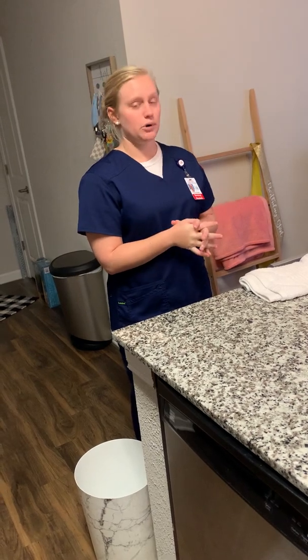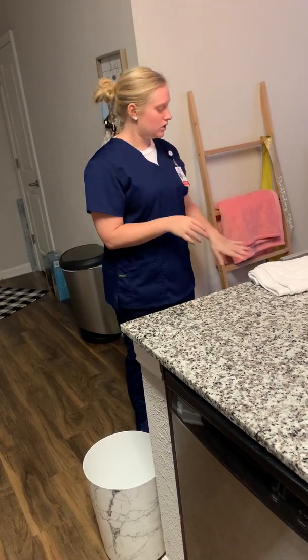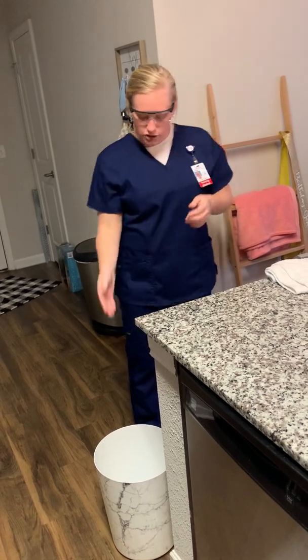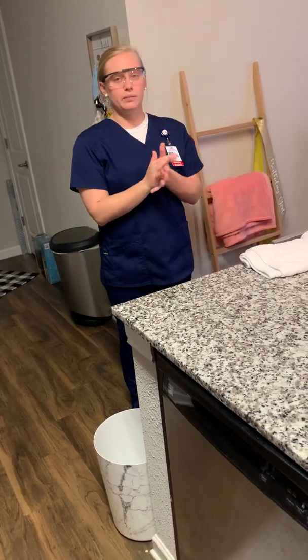I'm going to provide privacy for my patient, so I close the curtains, and then I want to gather all my equipment, which I have here. I'm going to don my goggles, move my trash can to a working position, and perform hand hygiene.